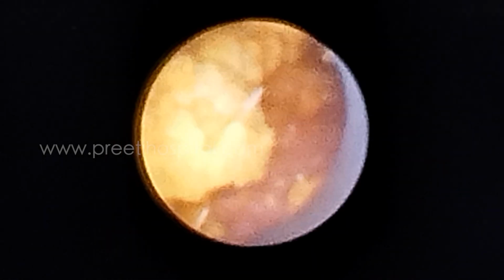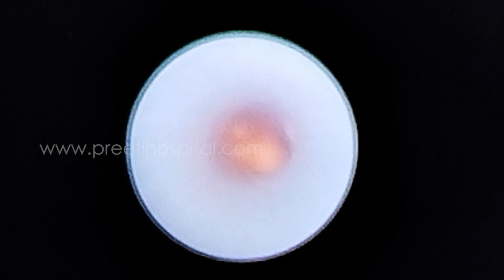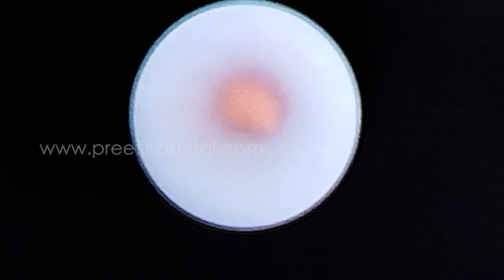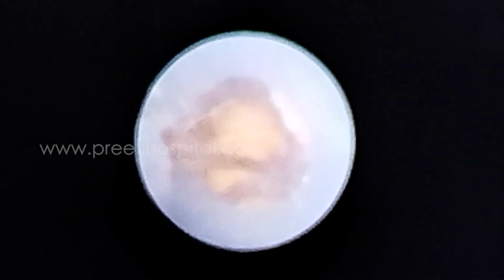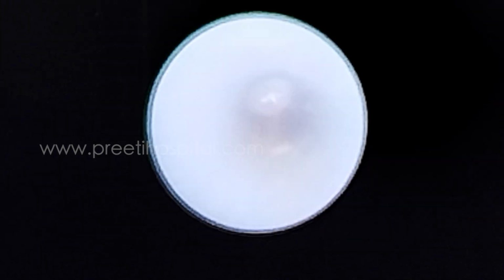See, this is actually not exactly calyceal because you have not seen the calyx properly. Why? Because the dye was not going. This doesn't mean that you have gone through the proper tip of the calyx. This may not be the tip of the calyx, I doubt. But no problem because it is not bleeding. Sometimes you are lucky that bleeding will not be there. But ideally, calyx delineation is a must.